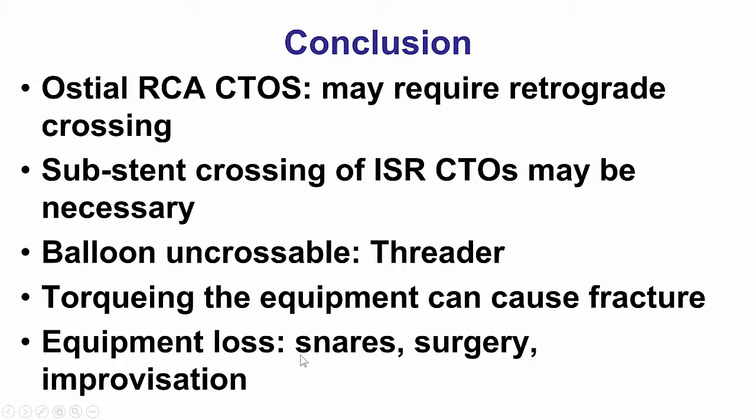In this particular case, this was achieved by just removing the guide catheter, and because the length of the balloon fragment was long, the balloon came with it and we didn't have any difficulty. It was a unique situation because the fractured balloon was over an externalized guide wire. If the balloon fracture had occurred in a standard angioplasty without externalization, it would have been very easy to just put a balloon inside the guide, trap the balloon fragment, and remove everything out without causing any problems.